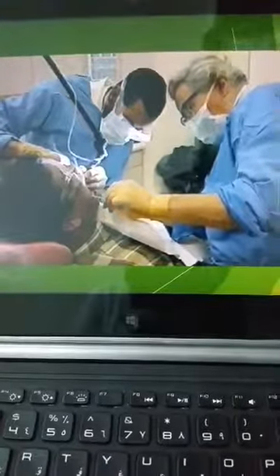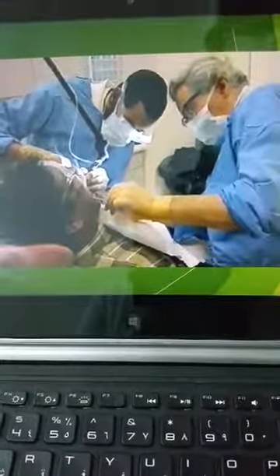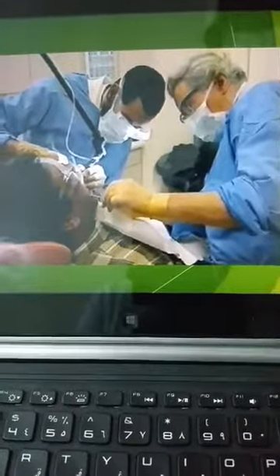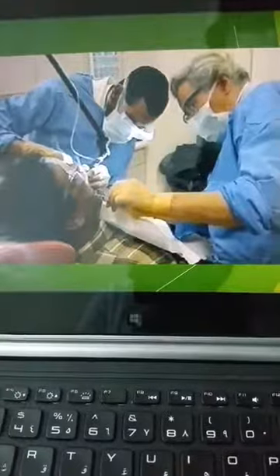You need training to use laser. This is my Professor Bradley. I used to do training under his supervision using the CO2 laser. It's a beautiful tool for soft tissue.